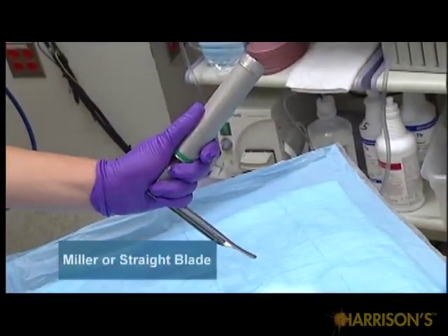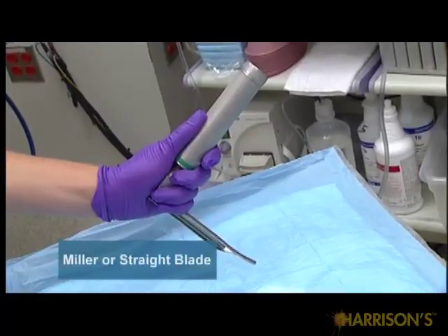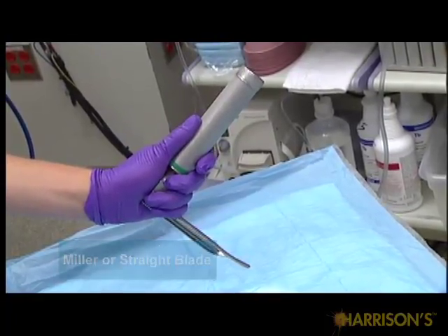The straight blade is useful in patients with an anterior larynx or a floppy epiglottis, as is typical of young children. When using a Miller or straight blade, insert the laryngoscope in the right side of the patient's mouth and sweep the tongue to the left.